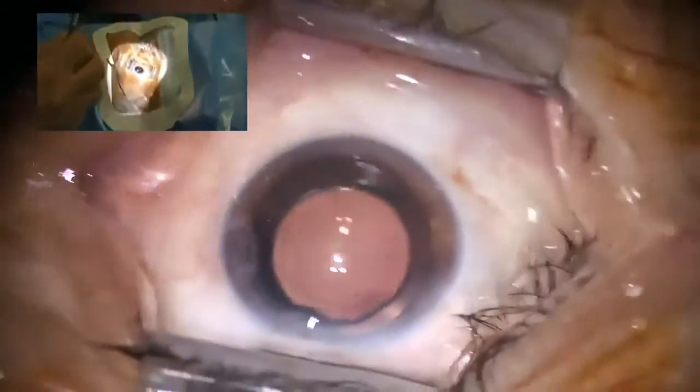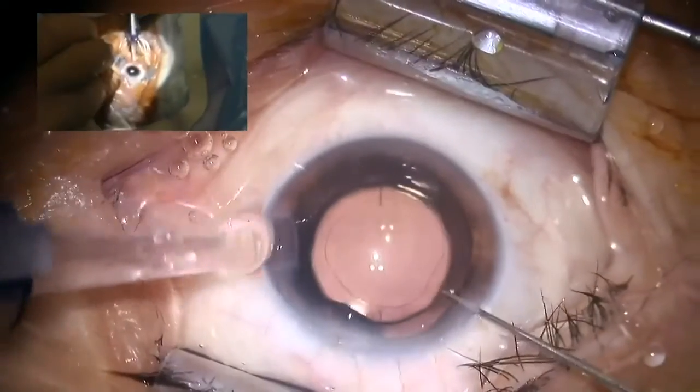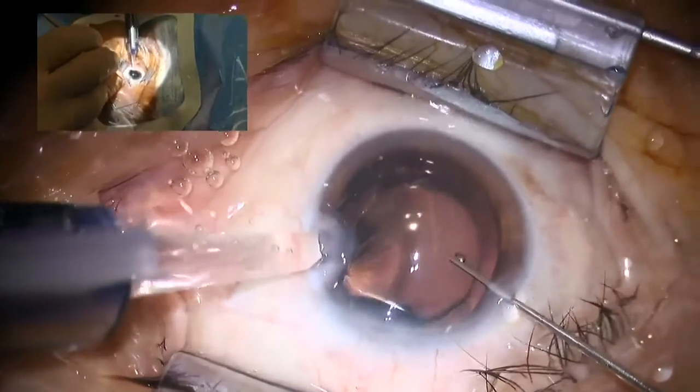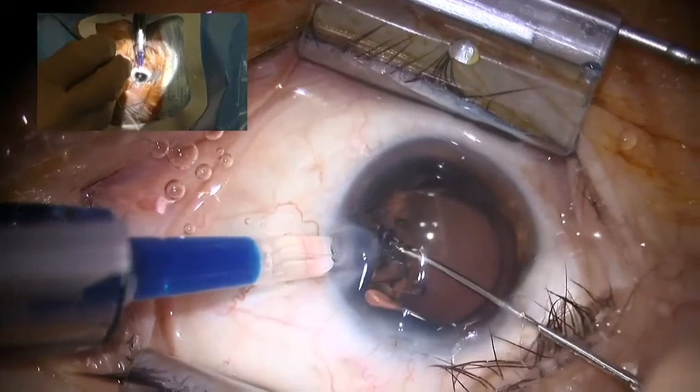I always use 2 instruments for the implantation, the push-pull and of course my injection system. This is on the one hand to stabilize the eye.